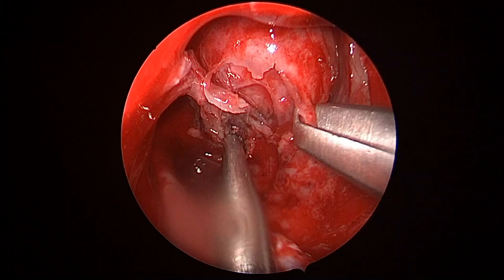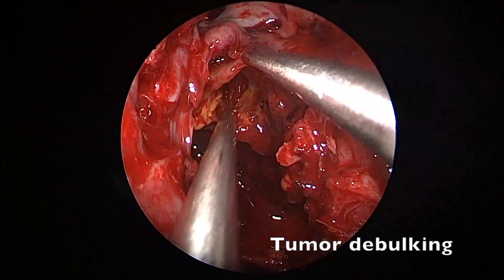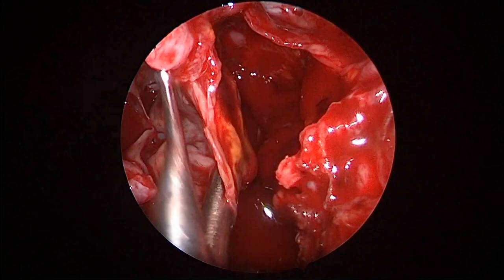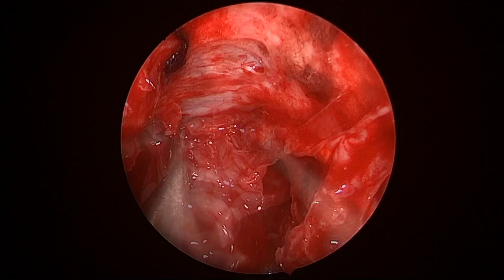We then removed the mucosa and the posterior wall of the maxilla to allow lateral retraction of the pterygopalatine fossa. We began removing the tumor by debulking the portion located in the sphenoid sinus initially, and then decided to perform an extracapsular resection of the tumor. After debulking, we were able to go around the tumor and perform a surrounding dissection, dissecting the tumor away from the planum sphenoidale, as seen in the imaging.